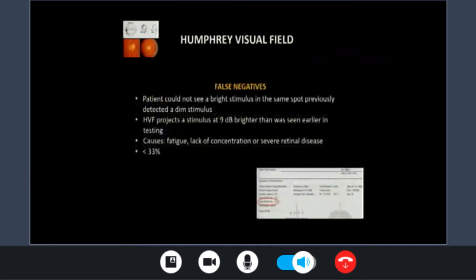Before going to the grayscale, there is something down here called the fovea. Please make sure before you do the interpretation of your visual field printout that the fovea is on. Why is that? Because it doesn't make sense that the foveal threshold sensitivity is 30 and some point at the periphery is 40, right? Your area of maximum vision is the fovea. So always ask the technician to keep the fovea on.